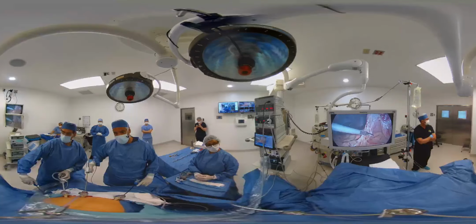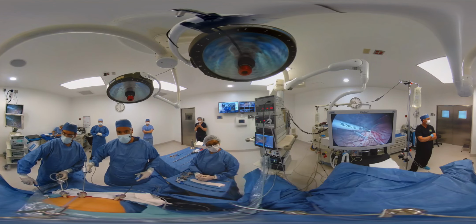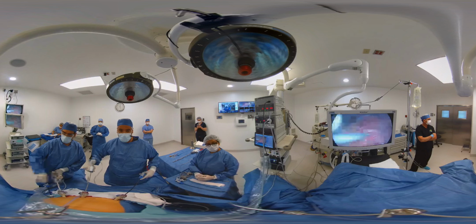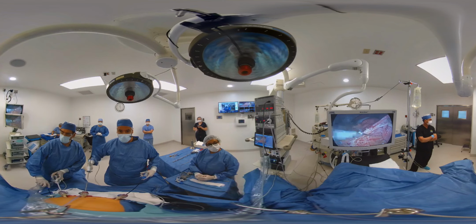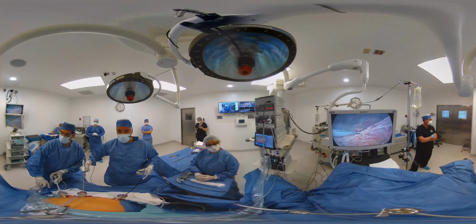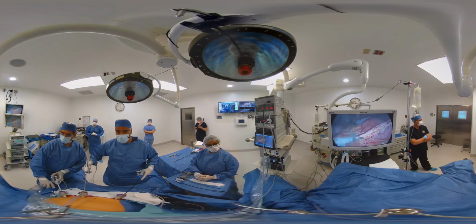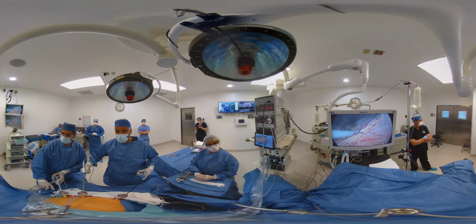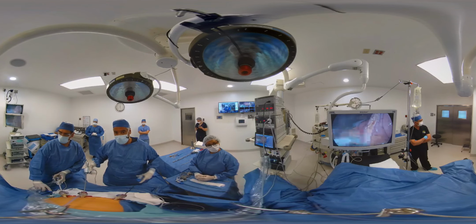So we can have here, you're seeing the last part and the outlet of the stomach. The outlet of the stomach attaches to the small intestine. What we're doing here is we're separating these ligaments that hold the stomach more or less into place, because we're going to staple it into a smaller sleeve-like looking stomach. Thus the name of the procedure, the gastric sleeve.